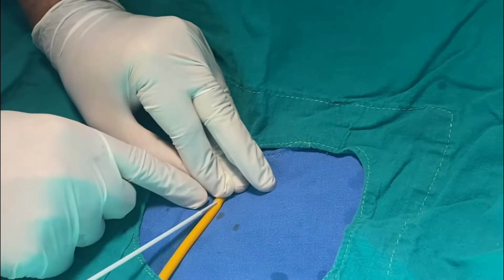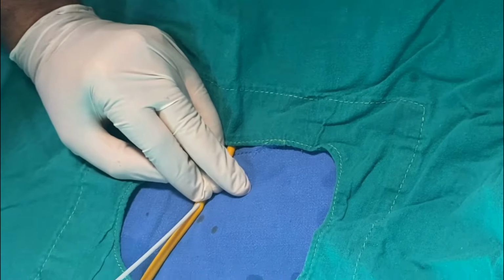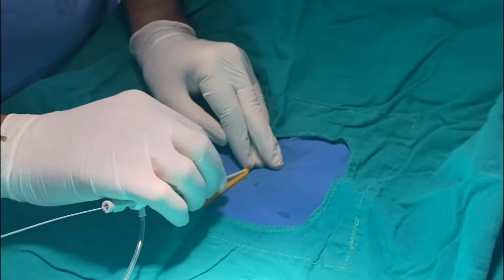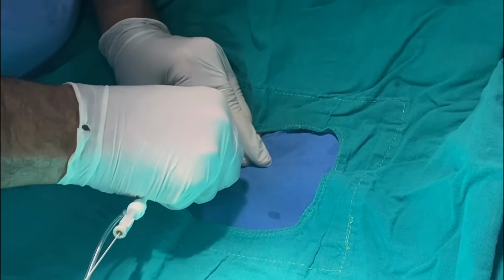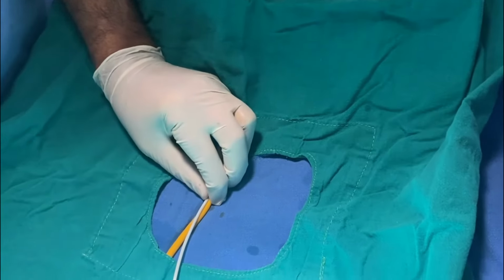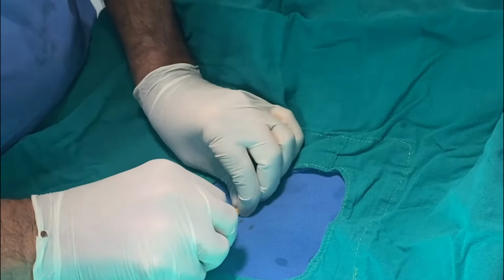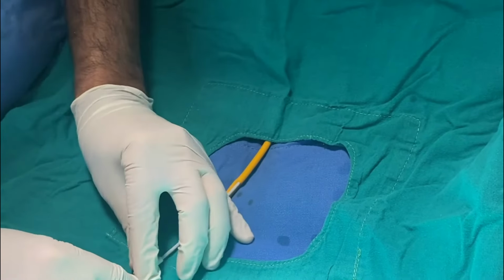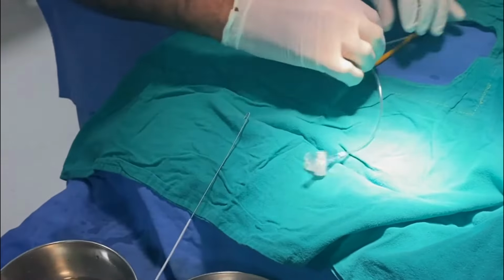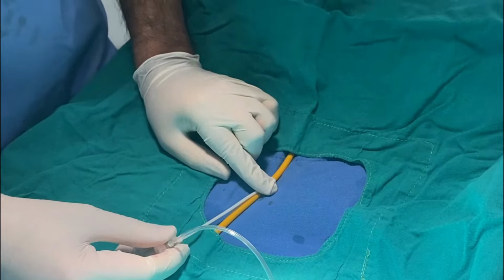The sheath will go in first with the introducer, and once it reaches here, you can take the small knife. If you want, you can put a small nick here with a knife, and with a rotating motion like this, like now. Don't just push it, because if you just push it, the tip of the sheath will get blunted. It will flare. So without that, you just rotate and push. Rotate and push. Rotate and push. Once it is inside, you can take this out, and once you take it out, you can introduce it completely. Here it will not go because this is a bladder catheter and it will not go easily.